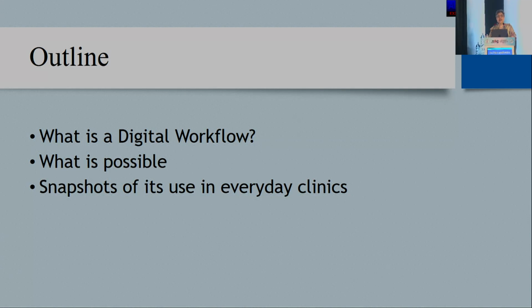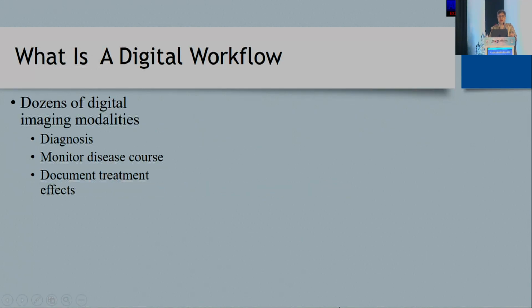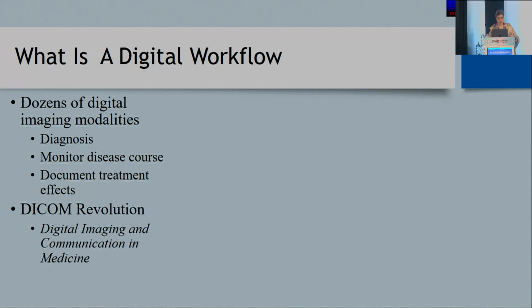So what is a digital workflow? What is possible? And like I said, snapshots of use in an everyday clinic. In glaucoma or retina or cornea nowadays, we have dozens of digital imaging modalities, and we use them to diagnose, to monitor, and also to document treatment effects.